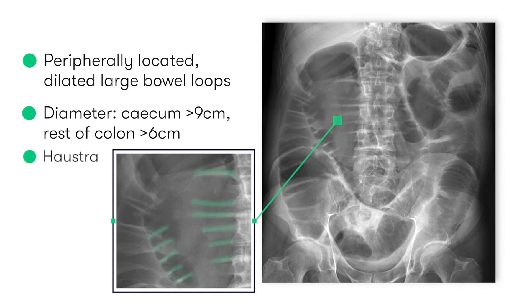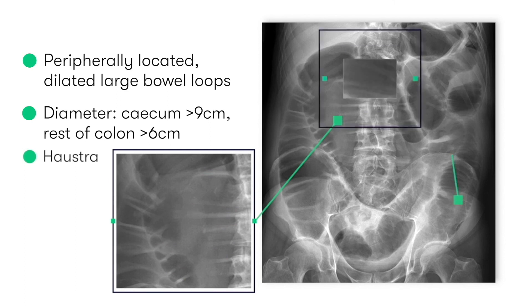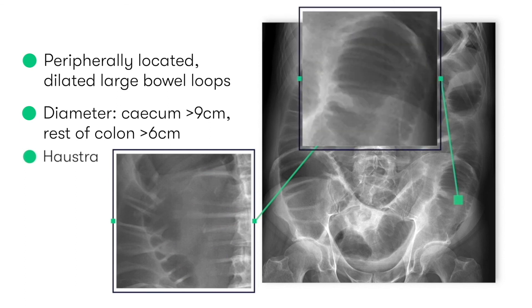These are different from the valvulae conniventes that we see in small bowel, which are fully circumferential folds of mucosa seen as lines that span the full width of the lumen of the small bowel on abdominal x-ray. With haustrae, these lines only partially span the width of the lumen.